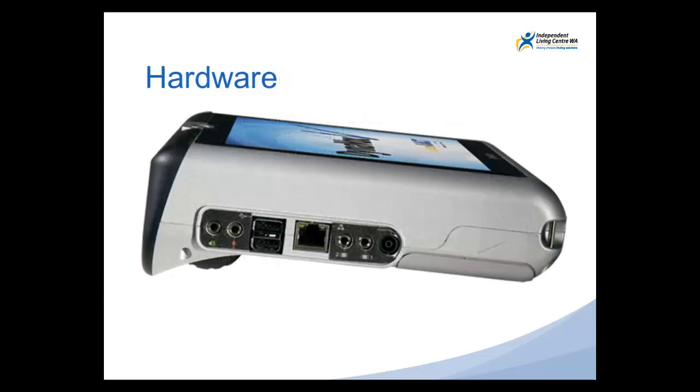Just briefly, I wanted to tell you a little bit about the hardware that's available. Just at the top here you can see the on and off button for this range of devices, and all of the devices have a side panel. Just along here you'll be able to see a speaker port if you needed to plug in a speaker for additional volume, perhaps for a school assembly. There's also a microphone port if you had a reason to plug in an additional microphone, perhaps to record some messages, though the device itself does have an inbuilt microphone.